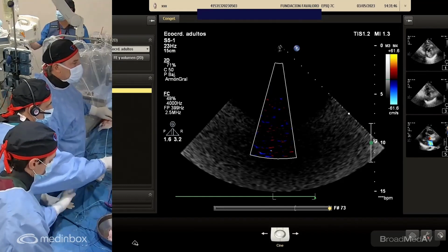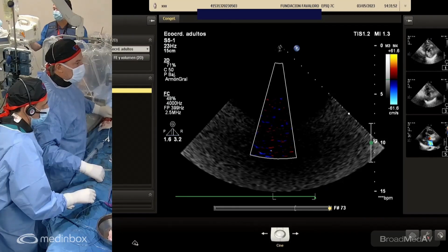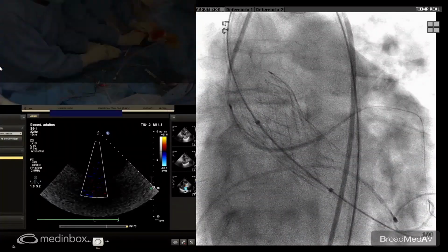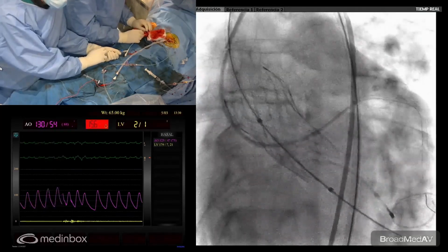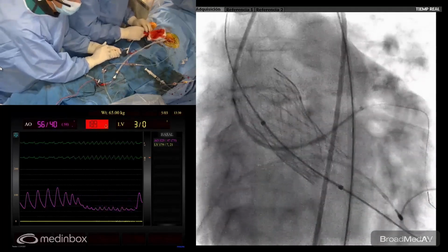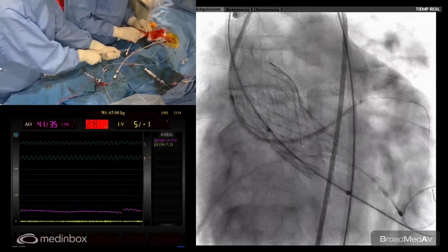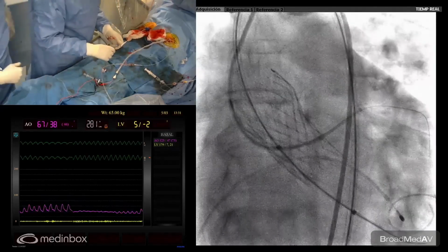It's important not having retrieved the catheter from the left main. Now we have to pace him very well at 180. Carlos, you have to wait until the blood pressure is down. Yes. Now, let's go. Deflate. Okay, I think the dilution was too much diluted. Okay, stop pacing.